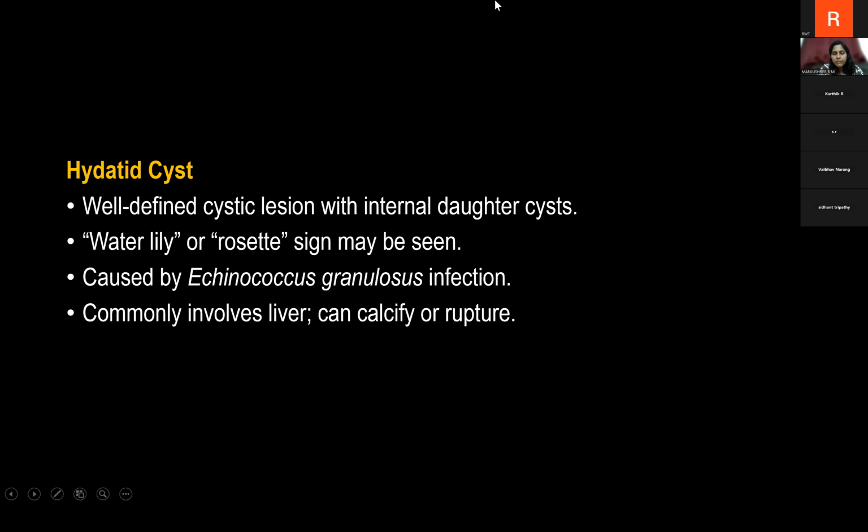Okay. So whenever it involves the lung, what is the typical finding in a pulmonary hydatid cyst? Yes, very good, Priyam. It doesn't calcify. Why? Why does it not calcify? Continuous movement, yes, that is also one of the causes. Yes, very good, Vrinda and Anushka. Because of less carbon dioxide and constant motion, the calcium will not precipitate. So there won't be any calcification in the pulmonary hydatid.